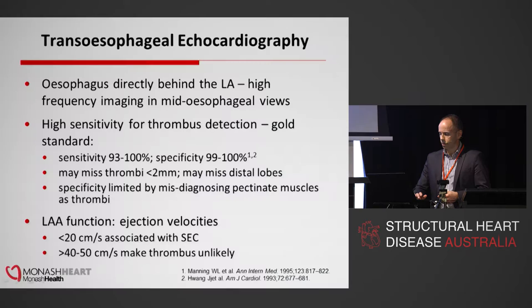The gold standard, of course, is transesophageal imaging. As Sean mentioned, it's the proximity of the esophagus to the left atrium, being a posterior structure, that allows us to use short field, high frequency imaging, 6, 7, 8 megahertz, which gives us that high spatial resolution. And the early studies from the early 1990s, two large prospective studies correlating with findings at mitral valve surgery for mitral stenosis, showed very good sensitivity and specificity.